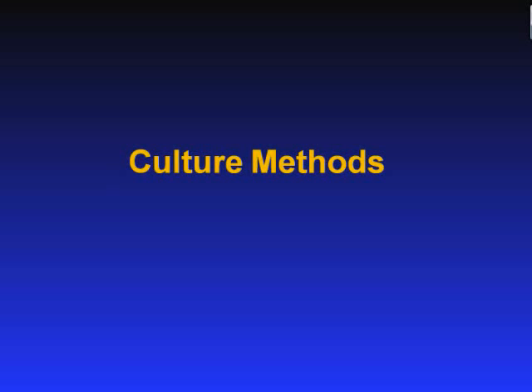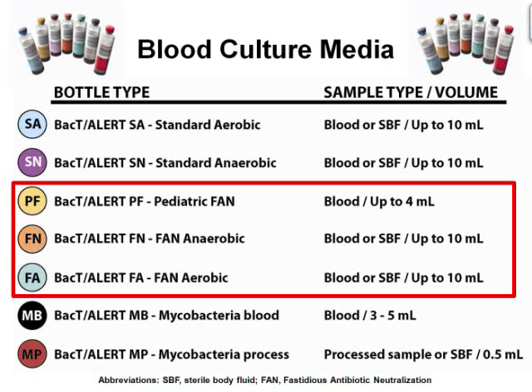That pretty much covers all I wanted to mention in the introduction section. Now let's move on to discussing some common culture methods performed for pathogen identification. The first culture method we will discuss is blood culture.